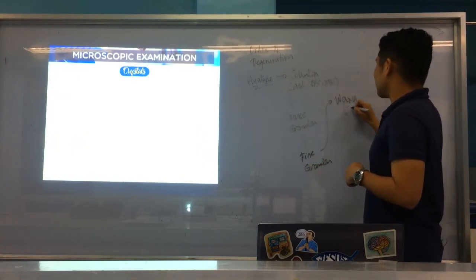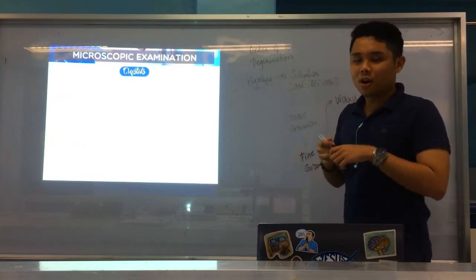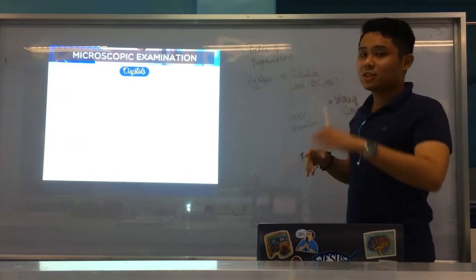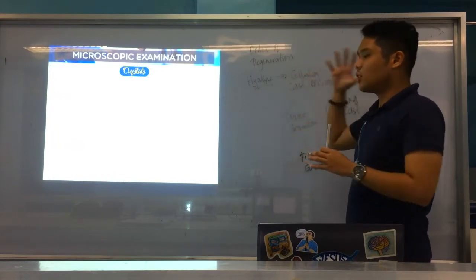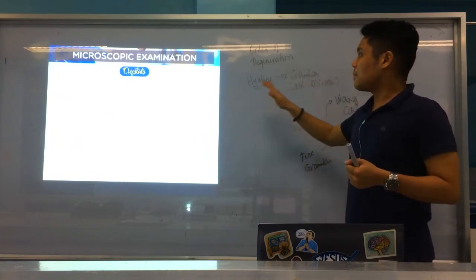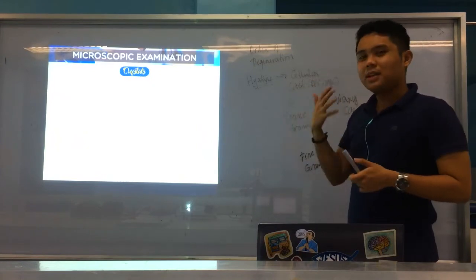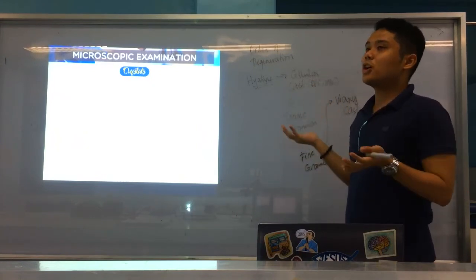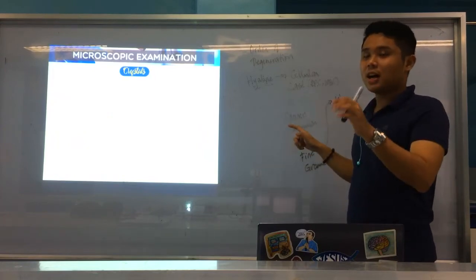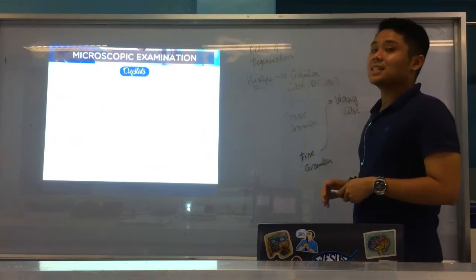So generally, that is the order of the degeneration of casts. From the very first, the template, which is hyaline. Next, of course, cellular. Whatever cells are in the tubule at the time the cast is created get incorporated here. So the cellular cast could be RBC, WBCs. And then, if it is prolonged or stays in the tubules, it disintegrates and becomes granular, first coarse, and then finally fine granular. And then last is, of course, the waxy cast.